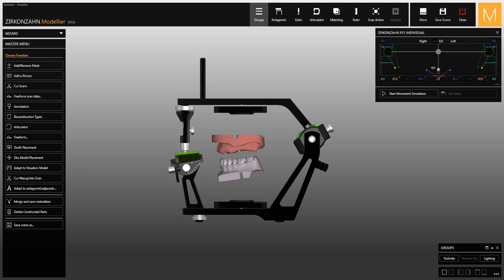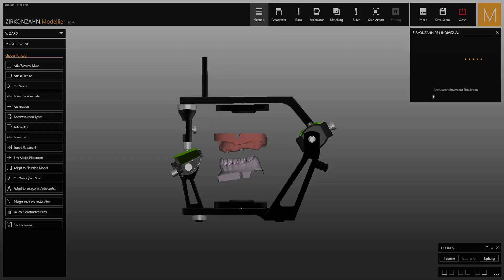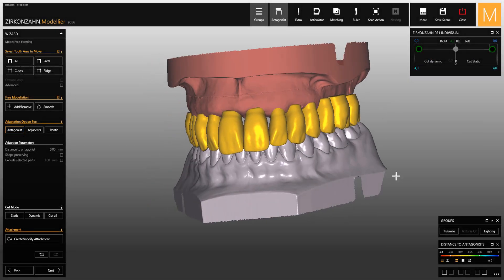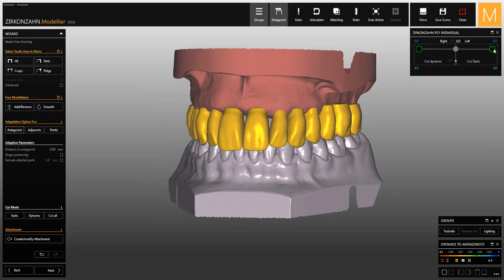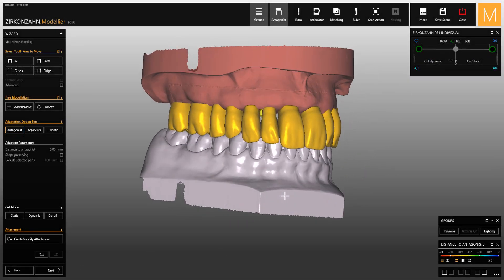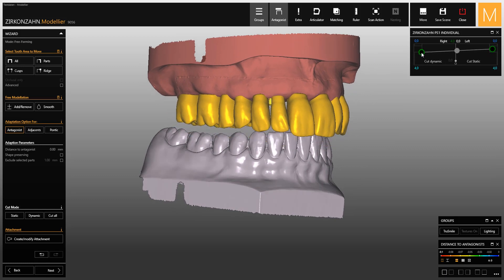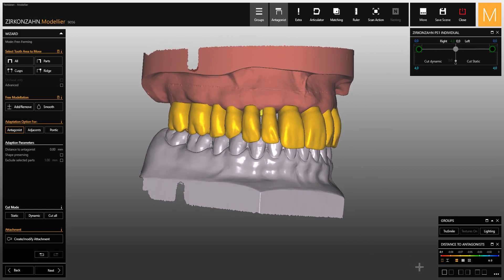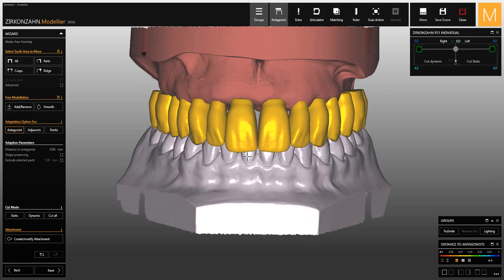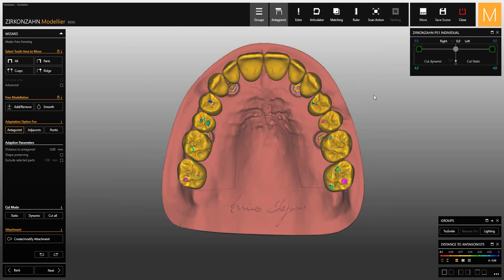A small window will open which will be permanently displayed, where you can simulate the articulator movements manually. In this window you can also cut the static and dynamic intersections to the articulator movements.